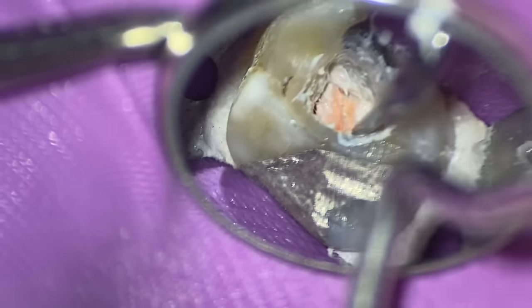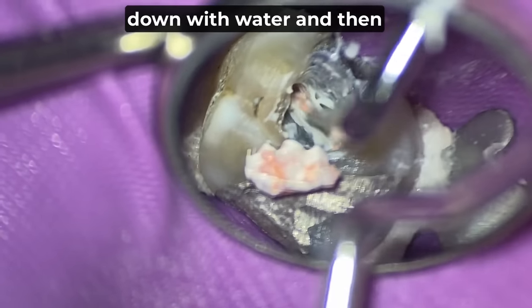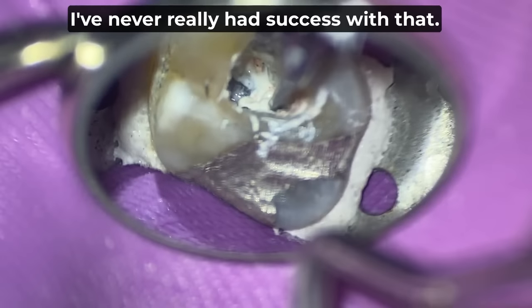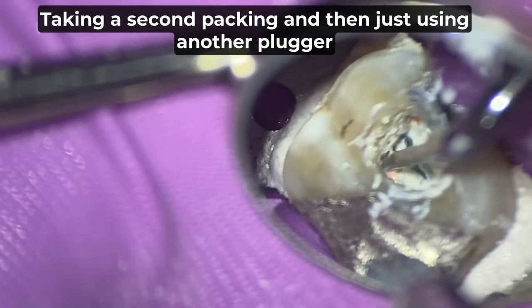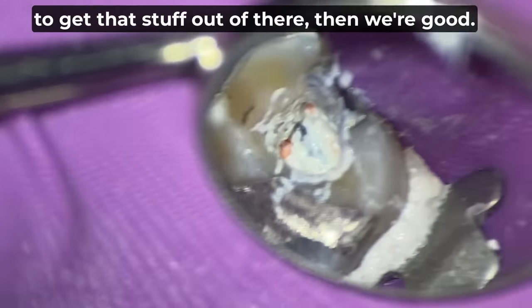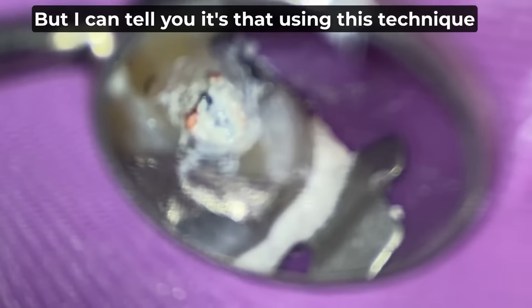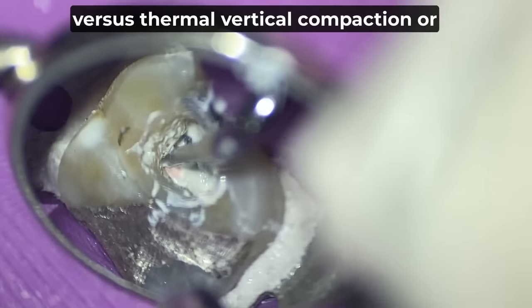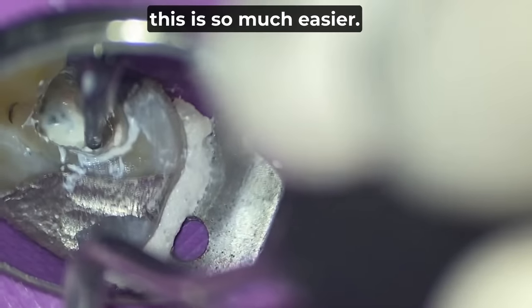You can also cool it down with water, and then maybe heat your heat plugger tip and make it attach. I've never really had success with that. Taking a second, packing, and then just using another plugger to get that stuff out of there, then we're good. We're not finished yet, but I can tell you that using this technique versus vertical compaction or a continuous condensation technique, this is so much easier.